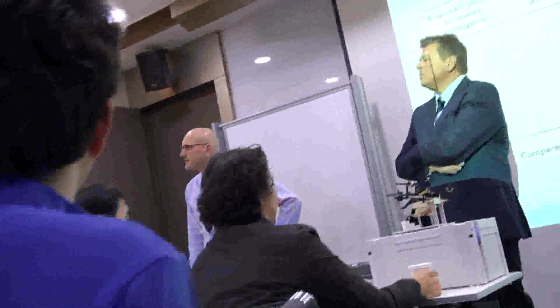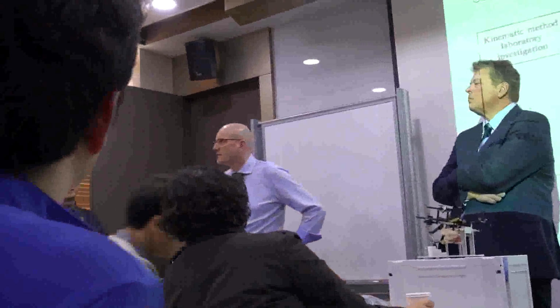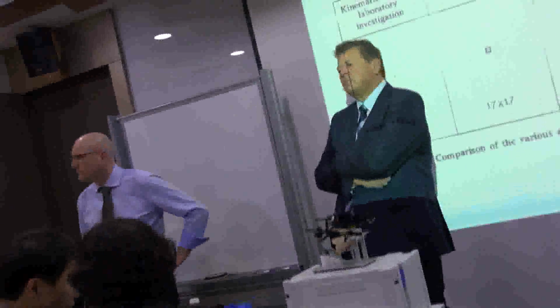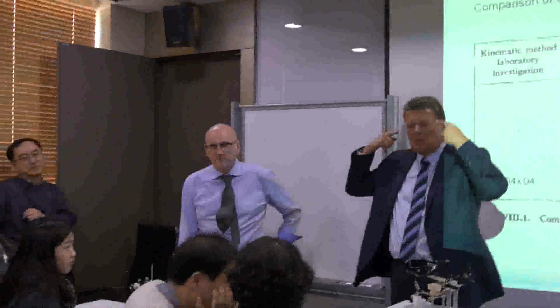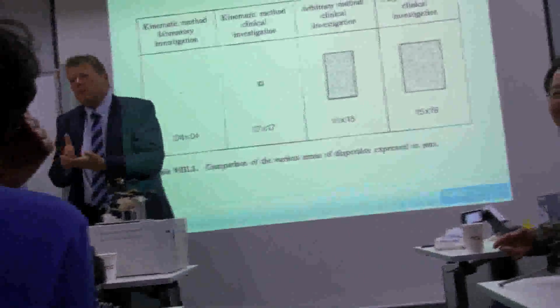The hinge axis is so horizontal, but the body midline, is that the right position? If that has nothing to do with the body midline... In the ideal patient, you're right, but the functional hinge axis can be translated to some other position, so this relation is not necessary to exist.